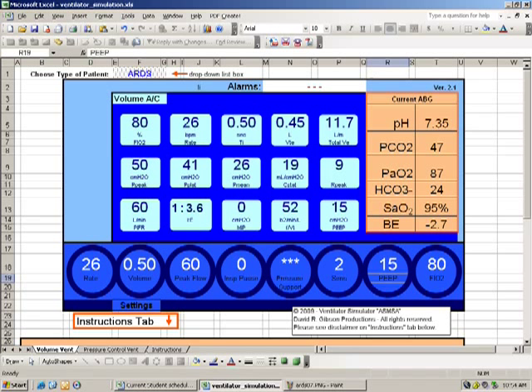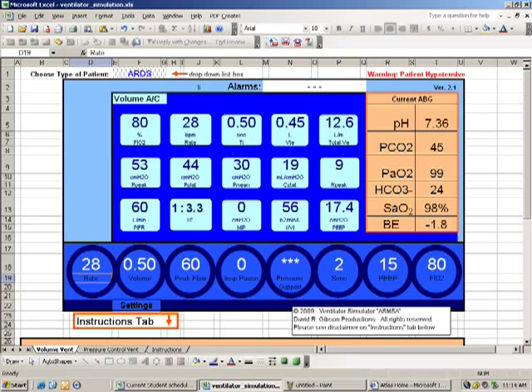In an effort to improve oxygenation beyond just 90%, the students suggested turning the PEEP up by another 5 to 15. Great suggestion, except for one thing. Compliance worsened slightly. You might notice that compliance changed dramatically from a PEEP of 5 to a PEEP of 10. One of the ways that you know best PEEP is the best compliance, best oxygenation, without the side effects of hypotension from cardiac embarrassment or venous return that's been slowed down. This next slide shows the hypotension up in the top right hand corner above the grid. It says warning patient hypotensive that occurred when we turned our rate up to 28 and our mean airway pressure went up to 30. This also happened when we tried to turn our PEEP up any higher, the patient became hypotensive. That's something that you just can't have, and so it had to be corrected.